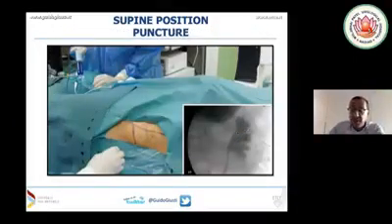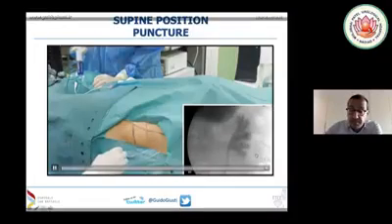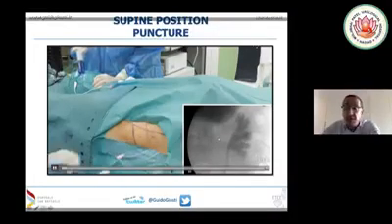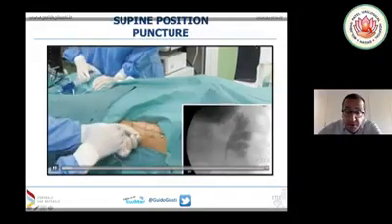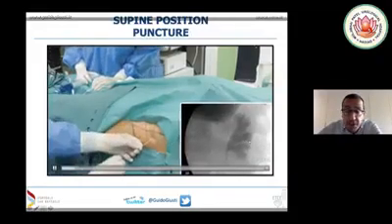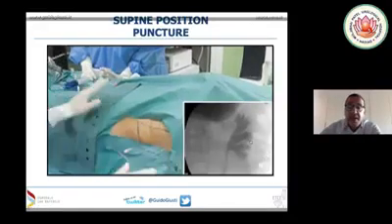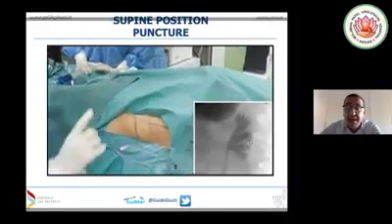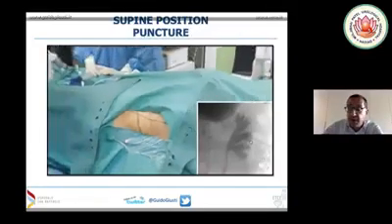Now I share with you this video that I recorded during a course that, unfortunately, I am usually not running. Okay, so this is in real time. You see, I target below the posterior axillary line. Look, I'm not moving the kidney, so I'm not in a good position. That's why I ask my nurse to rotate the C-arm 30 degrees toward the head of the patient.